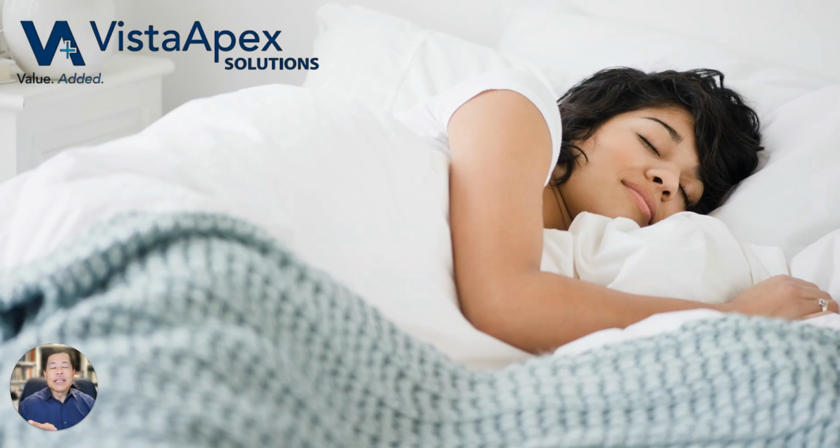One of the things that can sometimes make you lose sleep is when you do a root canal. Why? Because you spend all this time to clean all the canals out, and when you seal it up, you don't know if you have all the bacteria out. And we know that one of the primary reasons why root canal fails is because we have residual bacteria or tissue in that root canal system. And that can be very difficult for us when there's no way to tell.